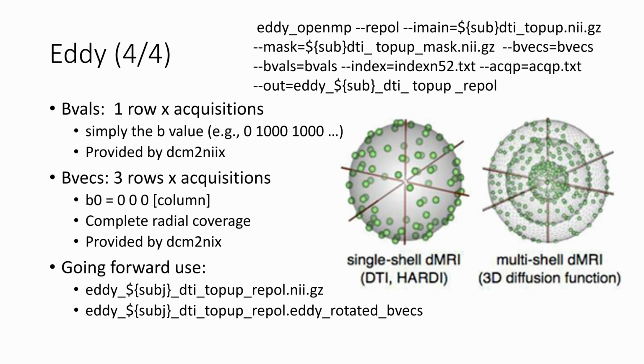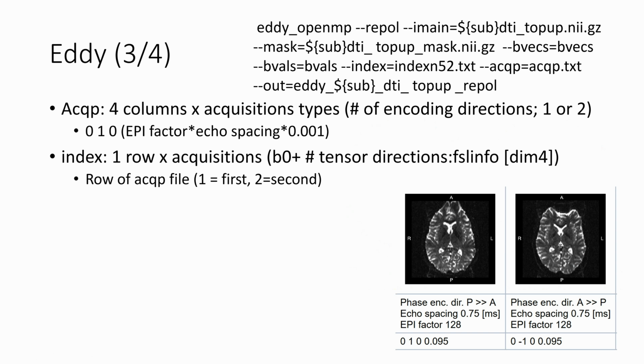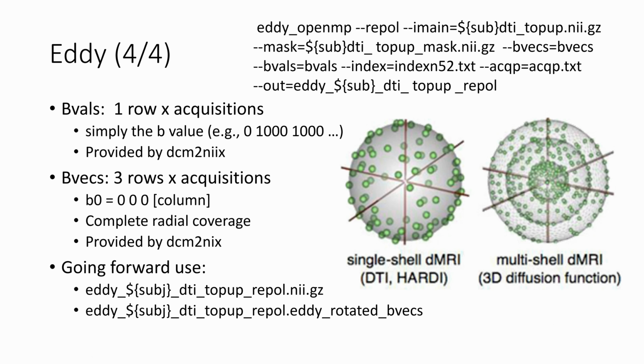Yeah? And you said that the adjacency helps. Yeah, just like how close another directional tensor is. The way we used to do it is we used to average the adjacent slices into that space, but that's somewhat imperfect because you're just assuming that that whole block of area is showing a similar direction. What's nice is being able to interpolate other directions so that you could then build up what the direction was on that one that you lost during acquisition.